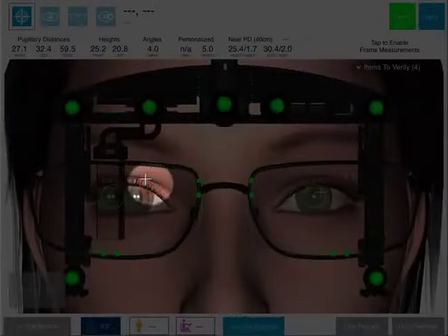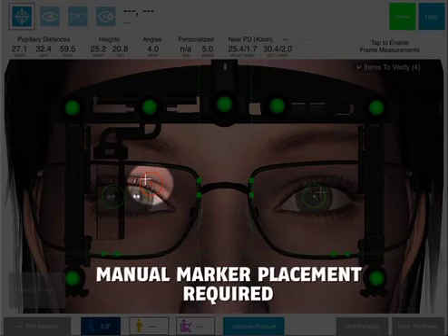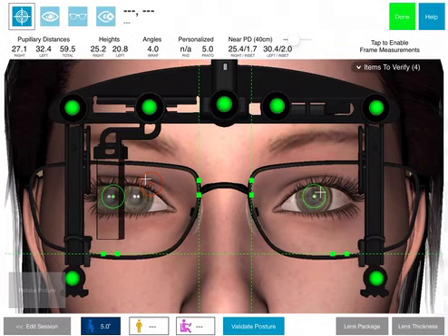Red measurement markers indicate that the software was unable to automatically place measurement markers with confidence, and user intervention is required to place the markers in their appropriate location. Note: only a pre-fit problem requires the retaking of the measurement image at this step. If markers were not found automatically, the image does not need to be retaken.